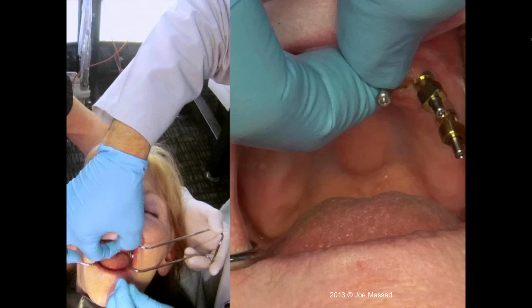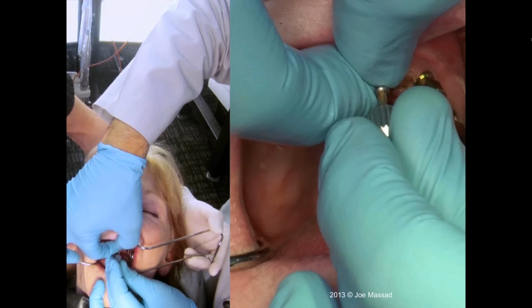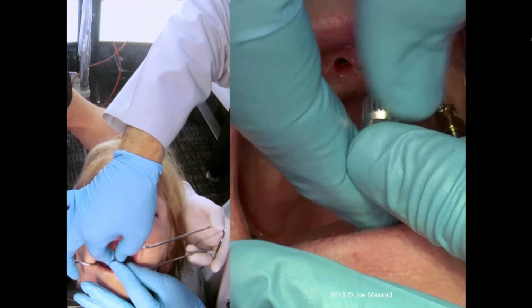As you see here now, I'm just leaving the screw out. I'm supporting the impression coping in, and then I begin to lock the screw. So tactilely, I've twisted in the impression coping until I could feel, in this particular case, the little trilobe on the inside. And once I knew that was locked, then I went in and engaged the locking screw.